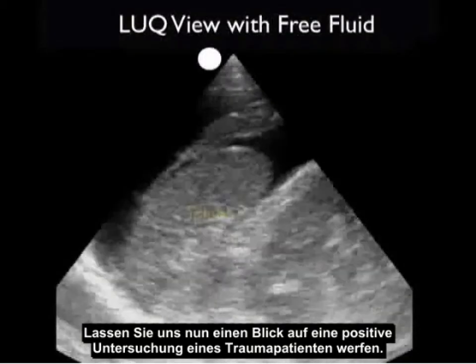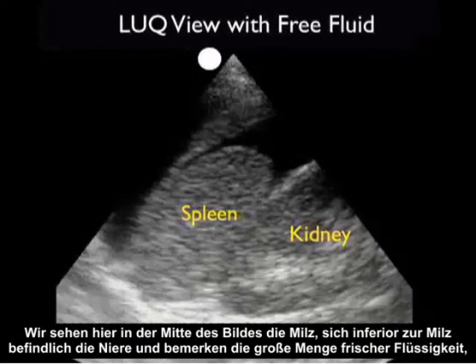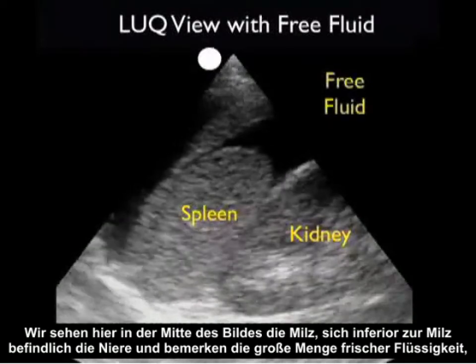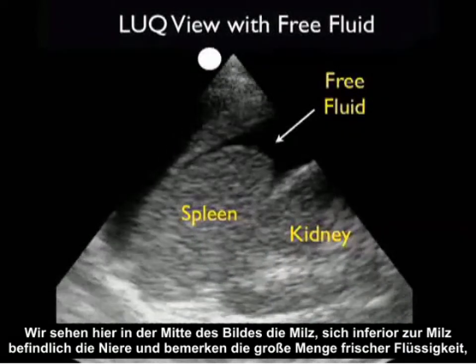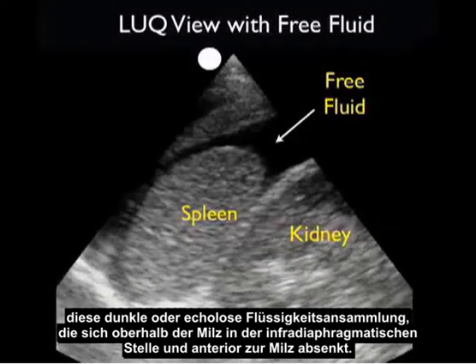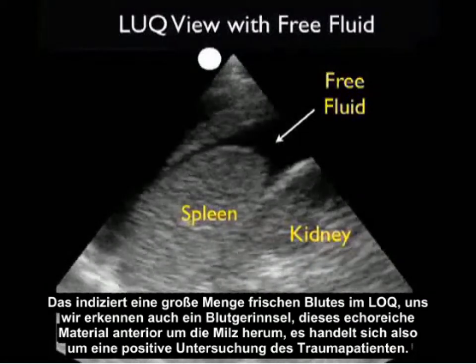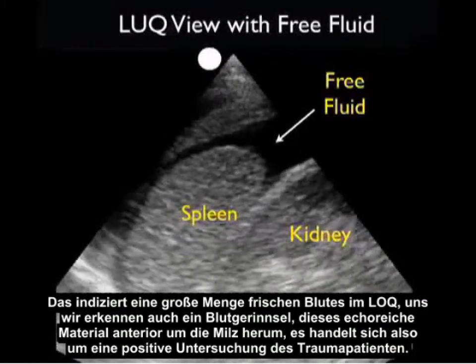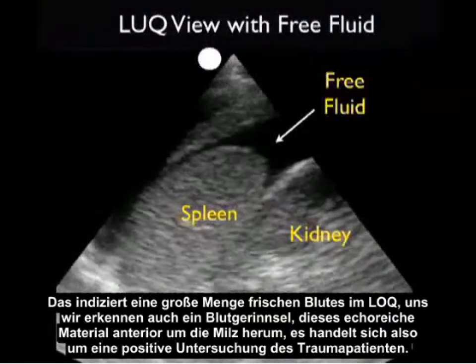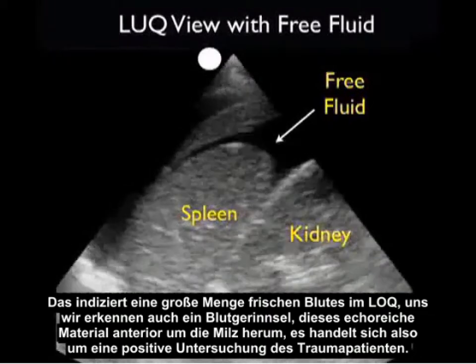Now let's take a look at a positive exam from a trauma patient. We see the spleen in the middle of the image, the kidney inferiorly, and notice the large amount of fresh fluid — that dark or anechoic collection — layering out above the spleen in the infradiaphragmatic location and anterior to the spleen. This indicates a large amount of fresh blood in the left upper quadrant, and we also see a blood clot — that echogenic material waving around anteriorly to the spleen. A positive exam in a trauma patient.